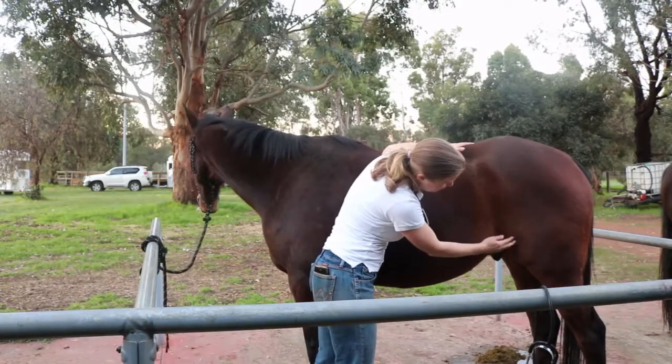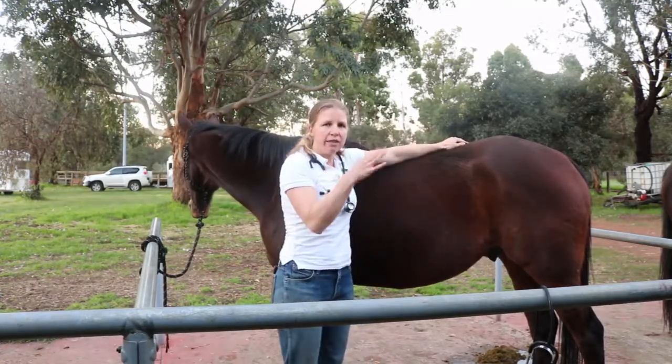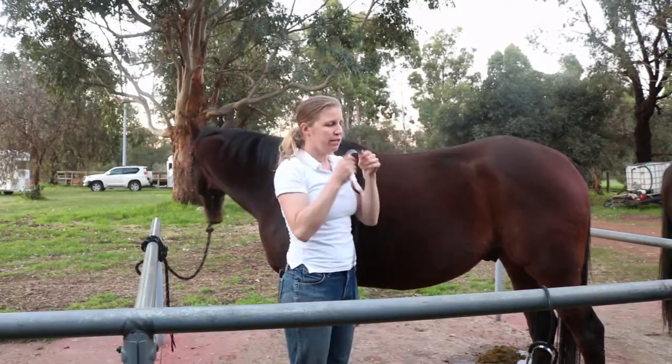The lower quadrant is just in front of the flank area. We do the same on the other side — those are the four areas that we listen to in the horse for gut sounds.